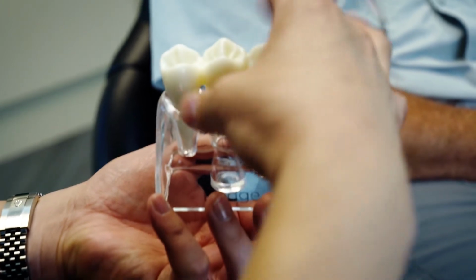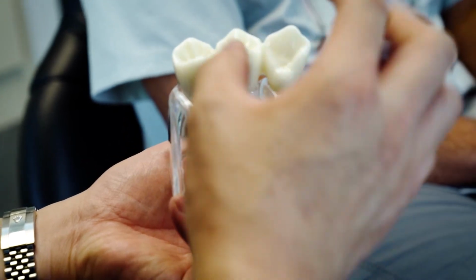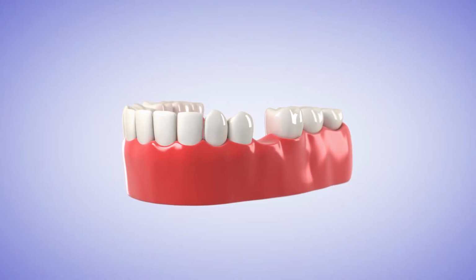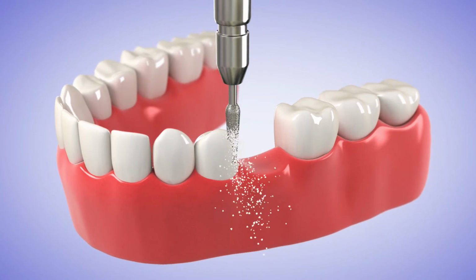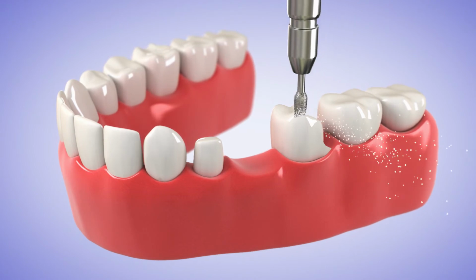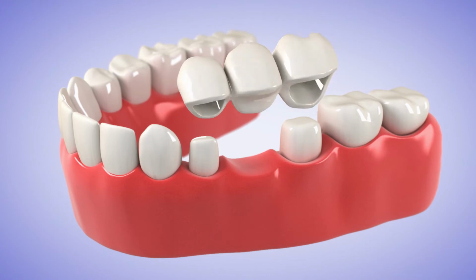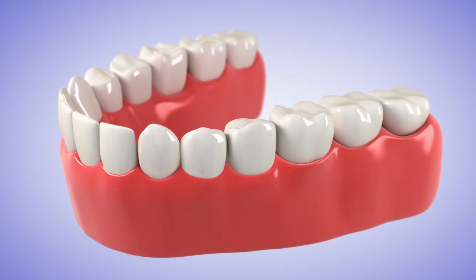Here in our office, dental implant is the best option that we can offer our patients to replace missing teeth. The alternative is commonly called a bridge, or a fixed partial denture. Conventionally, when you're missing a tooth, we have to use the adjacent teeth. We have to grind down your healthy teeth, take an impression, and then replace those missing teeth. But the negative side is that once you start grinding your teeth, their life expectancy is reduced by half.